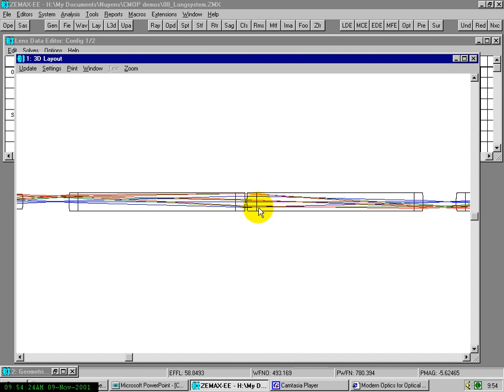And you can see that somewhere in this area the principal rays again pass through the optical axis. So it looks as if we have an image of a stop here. These two lenses here are very near to the object and the image, and they are more or less field lenses. And the significance of those lenses we will see just now.